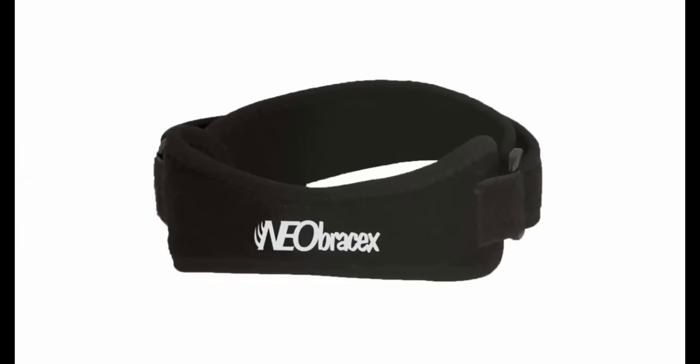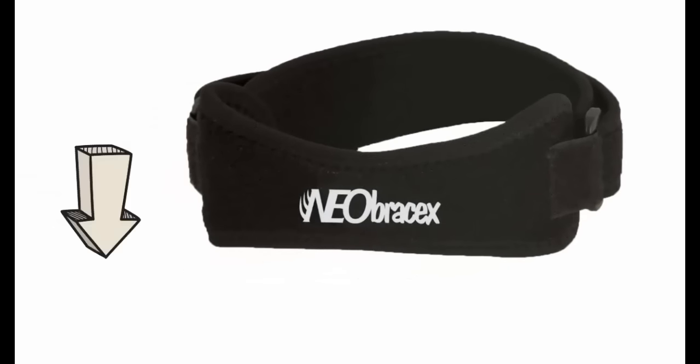Then the Neobraces Patella Tendon Strap is the right answer to relieve your knee pain. It supports the kneecap so you can exercise without worrying about knee pain. It gives you immediate relief.